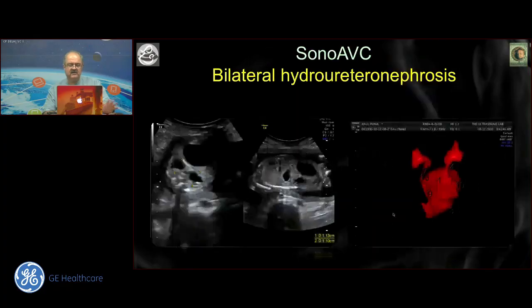You just take a clean sweep. Again, you suspect that, of course, these must be bad kidneys. There's a shaggy cortex which is thinned out, and 2 spaces here at the back of the fetus, and there's a bladder almost coming up. And then you try and do it, and you say, yes, of course. There's an inversion and then a color assignment that is a part of the software. You have to just press a single button, and you realize that they're very, very short ureters, that there's bilateral hydronephrosis, and a hugely enlarged urinary bladder, about 10 times as large as each of the kidneys.